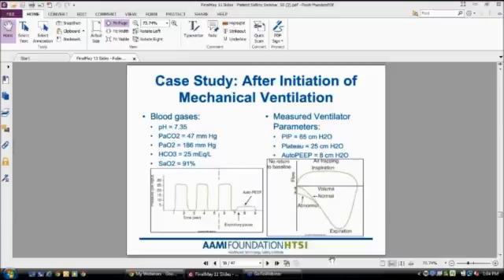So to get this patient better and fix this alarm from going off, we may want to flip the patient to pressure ventilation as opposed to volume ventilation, which he is in now. This would minimize the chance of pneumothorax in this patient.